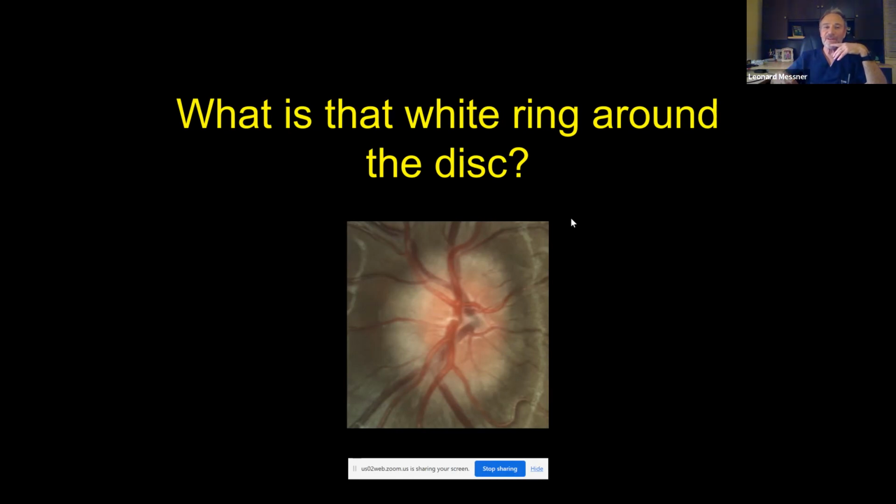What they will present with is a pale appearance to the optic nerve. That's a whole different lecture, but that's where we have this interplay at my institution, where we're juggling patients back and forth between neuro-ophthalmology and glaucoma. Is this normal tension glaucoma, or is it something else? And it goes both ways. But I guess that's a roundabout way of saying that a compartment syndrome is nothing more than an optic nerve that has a small hole in the back of the eye. Or that's an optic nerve with a small compartment, I should say.